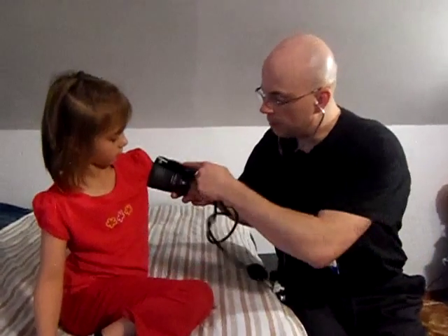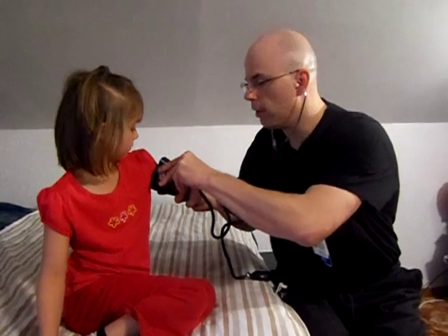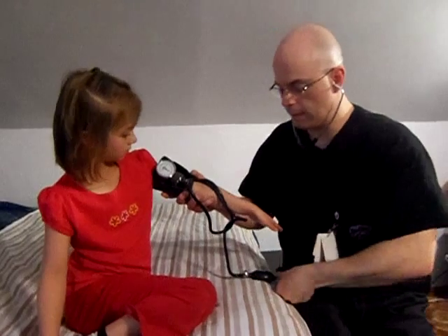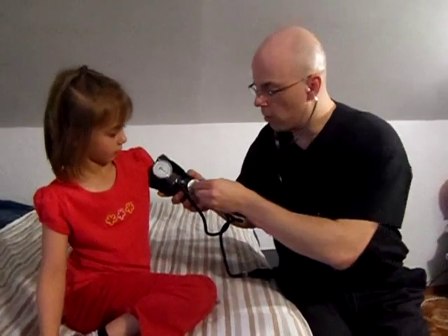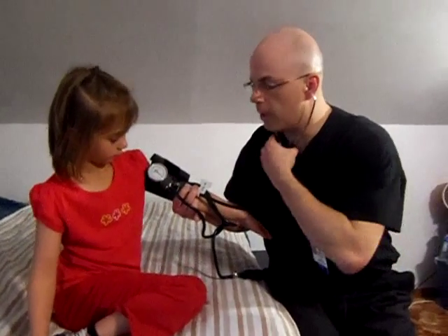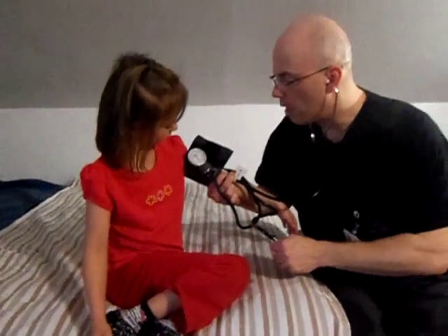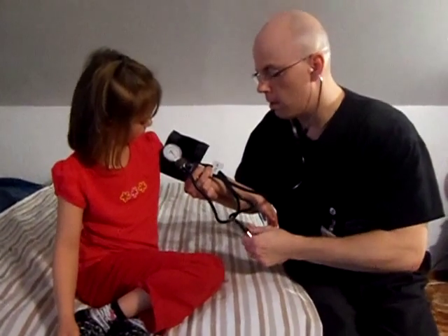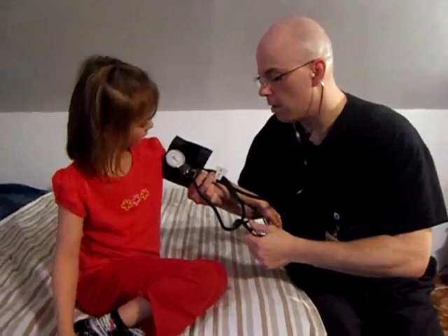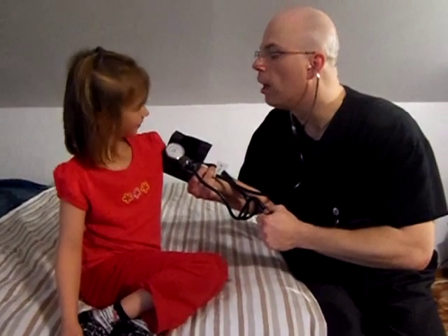She's been sitting here still for a few minutes. For a good resting blood pressure, the patient will be sitting still for 5 to 10 minutes. So we'll put the stethoscope in place, hold it with fingers, not thumb, because we can actually hear our own pulse. If we do that, totally deflate the cuff. Now we'll close that, start to inflate.